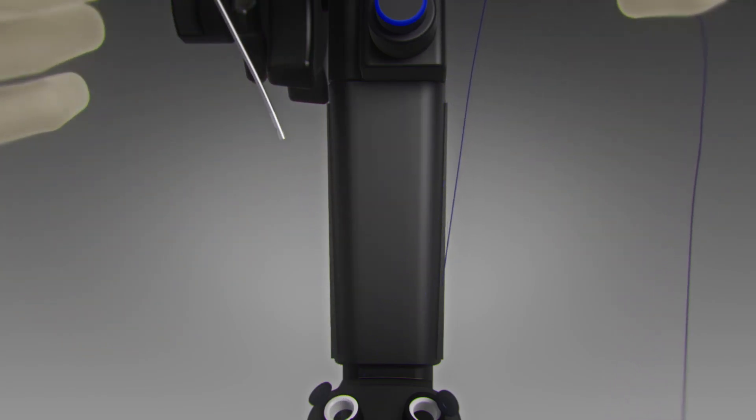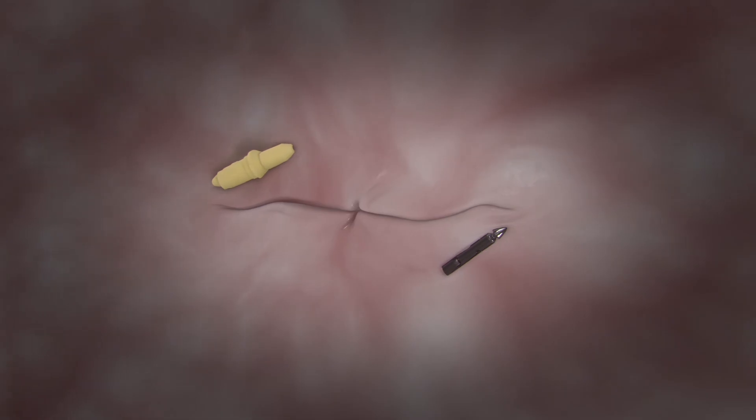Remove the cinch and suture from the scope channel.